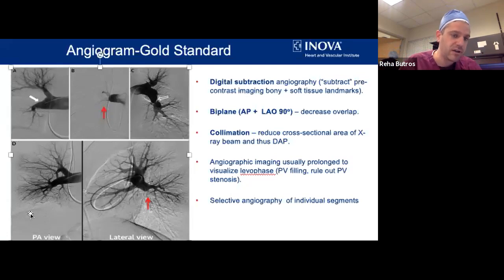If you only do one view, you could say, okay, this looks normal. The only caveat would be that the vessels maybe are not going to the very periphery of the pleura, but you don't see any abnormal vessels. Well, if you do the lateral view on the same lung, you're going to see that this whole lower lobe is absent. So that is the nubbin of that segmental branch, in segments 9 and 10, that's completely absent. And you see no flow in that corresponding lung.